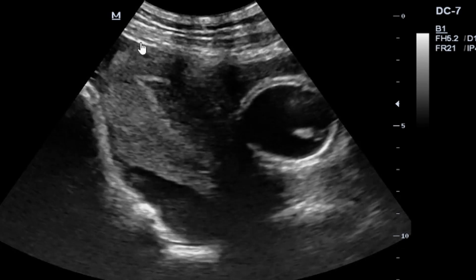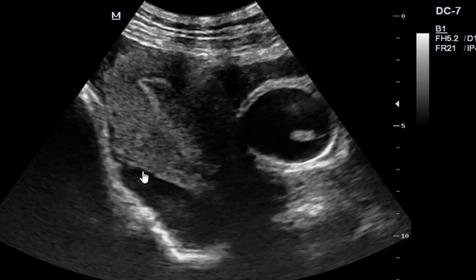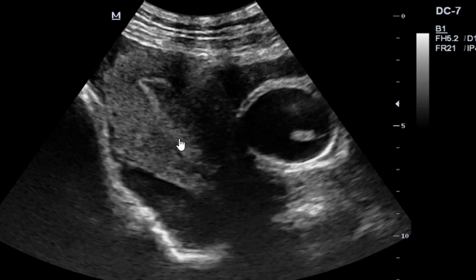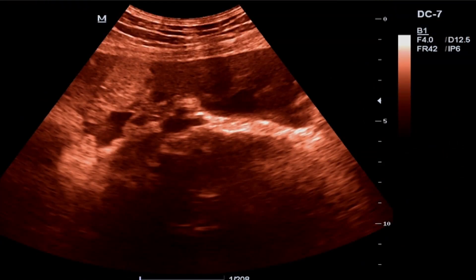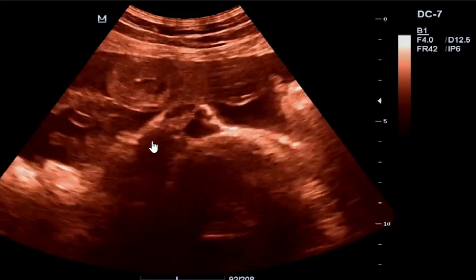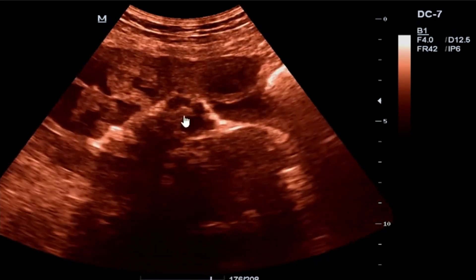There's free fluid around the uterus — this is the cul-de-sac. This free fluid here — this is the myometrium of our uterus, and then what you have here is our endometrium without a gestational sac or any portions of the fetus. So this is actually consistent again with a ruptured abdominal ectopic pregnancy.